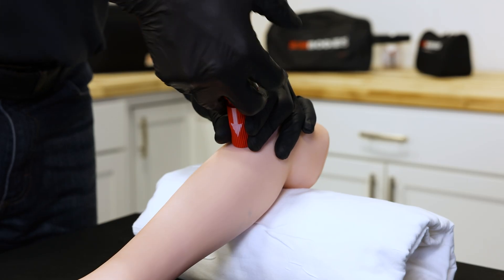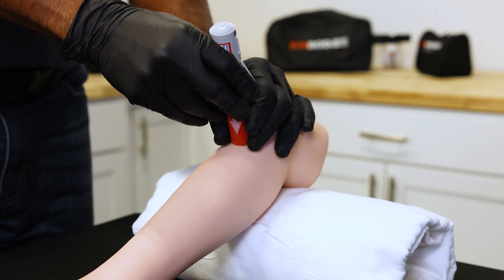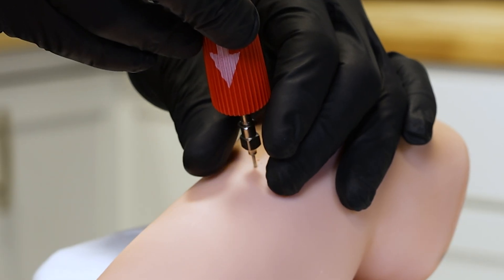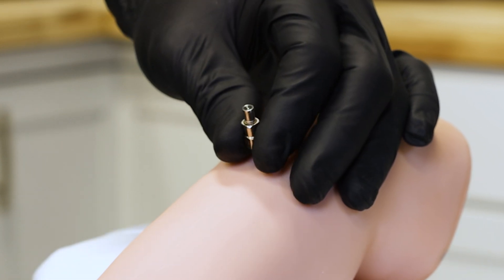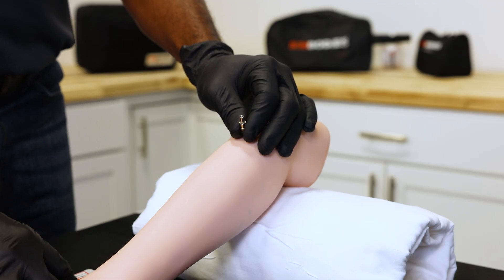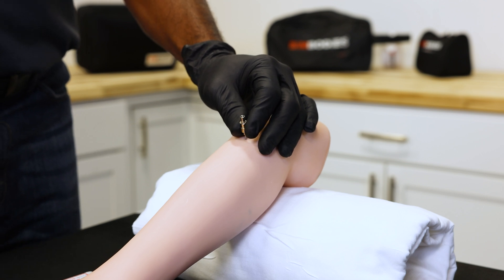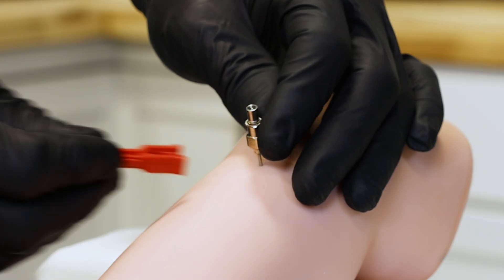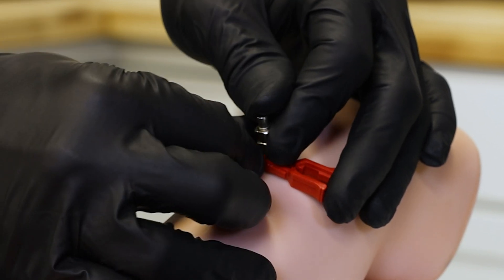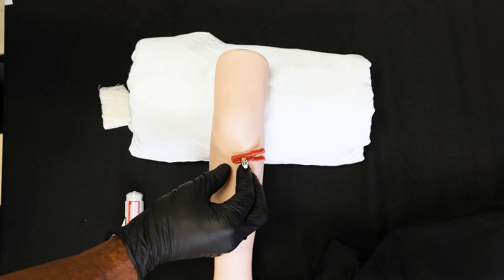Once you have deployed the device, remove the barrel leaving behind the metal needle. Keep the needle stabilized with two fingers while you access the red safety latch you have stored nearby. Stabilize the needle with the red safety latch, ensuring you don't move the needle. Then apply medical tape to stabilize the red safety latch.